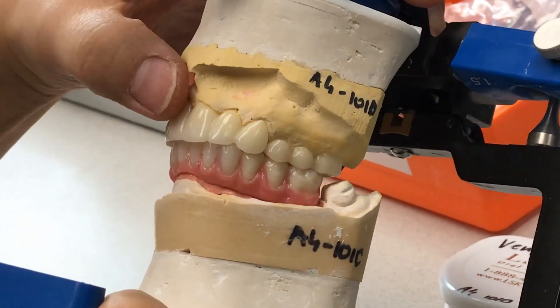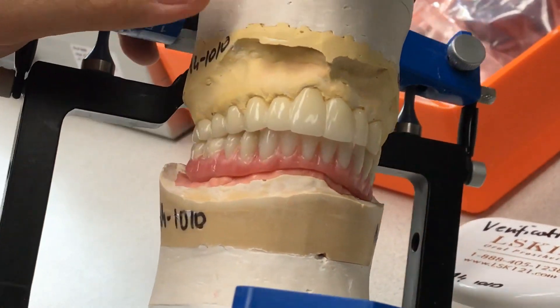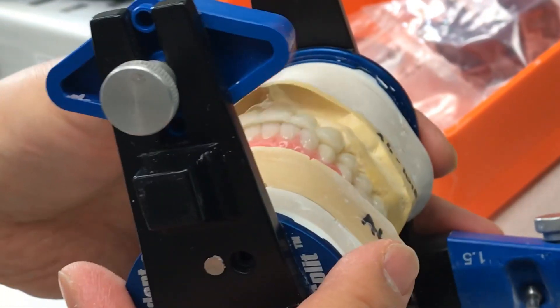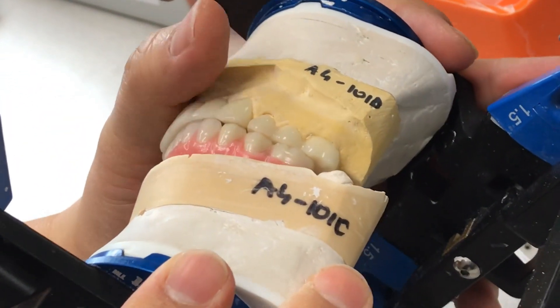Now these are prototype upper full-mouth fixed restorations, but the lower will be screw-retained zirconia. The reason is I grind more underneath so the doctor can reline.